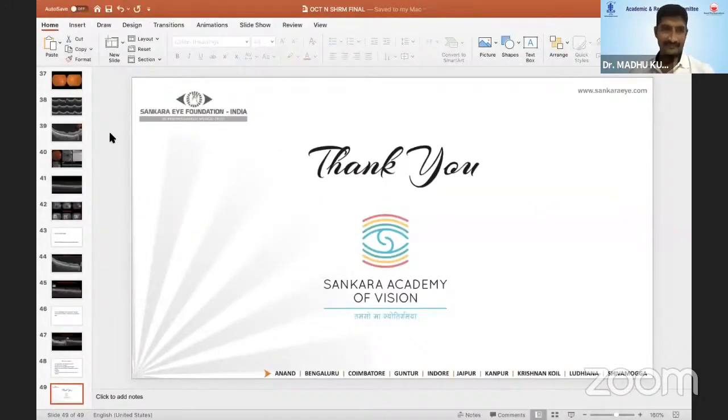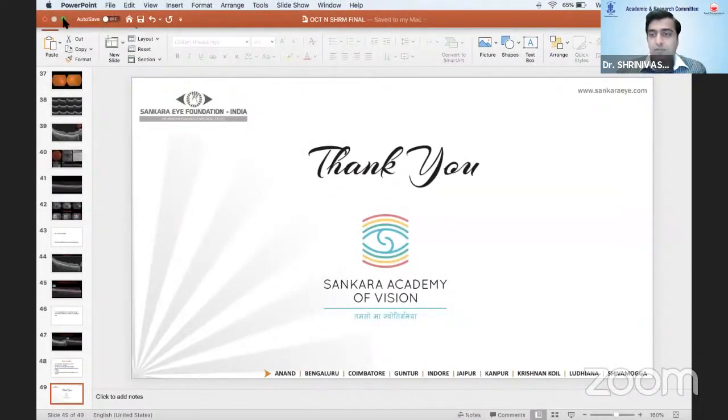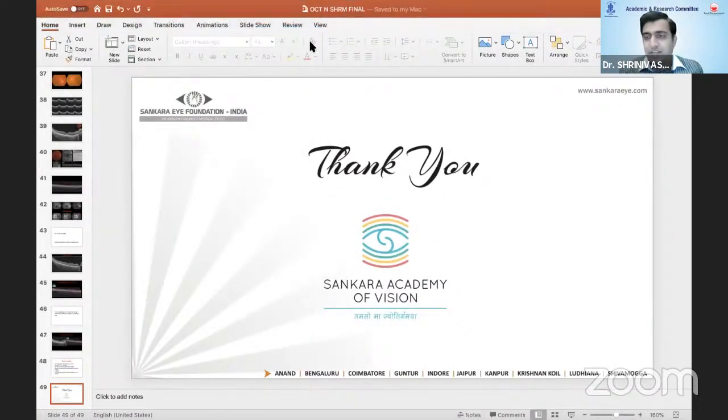Thank you, Madhu sir. I think that was a fantastic talk from your side. Just one question regarding the SHRM. It's a very vague terminology. As we know, it can present as blood, it can be a scar, it can be a CNVM membrane, or it can be hard exudate clumps, as you showed. So is there any indication that these are the SHRMs which definitely require confirmation with OCTA or fluorescein angiography, and these are the SHRMs which need treatment? Any specific characteristic you would like to tell us about?